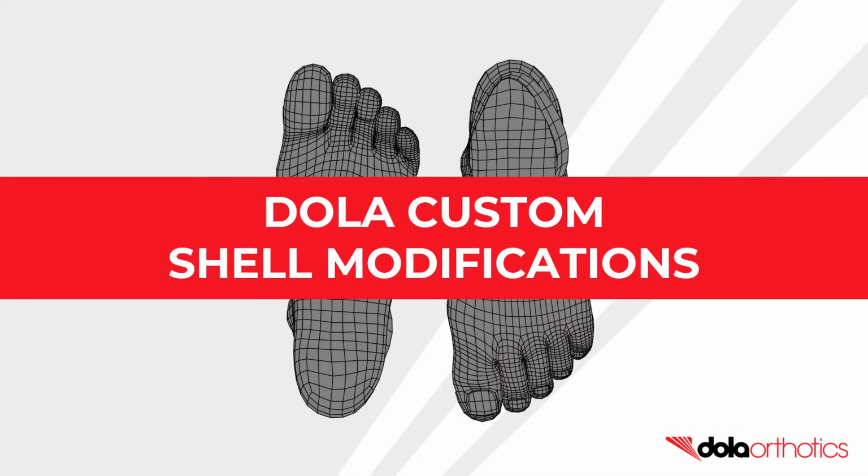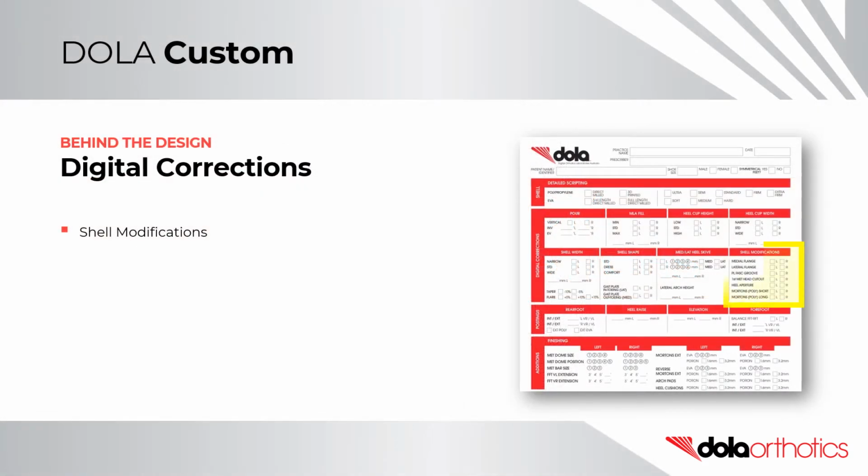DOLA Custom Prescription Education, Shell Modifications. Behind the design, digital corrections. This section of the presentation will explore shell modifications, including flanges, first met cutouts, plantar fascial grooves, heel apertures, and Mortons extensions.